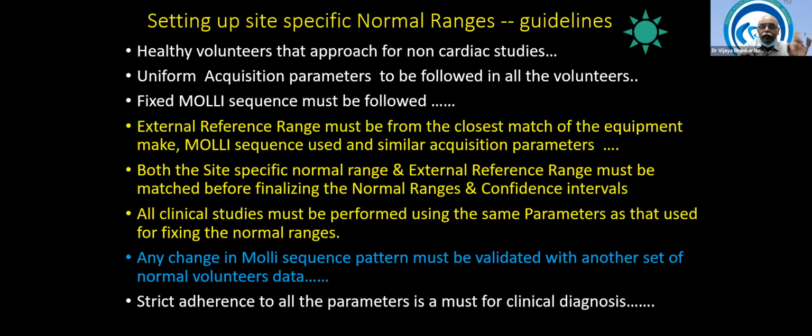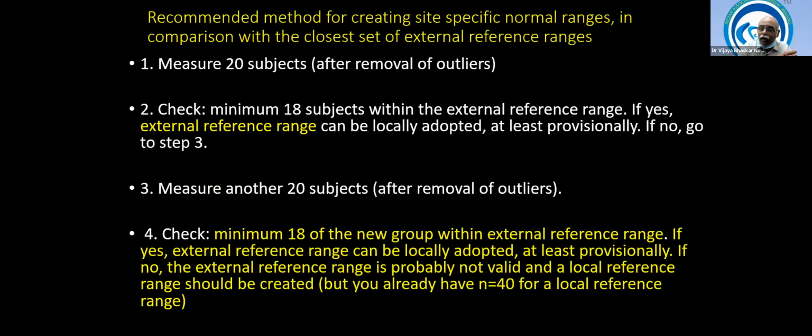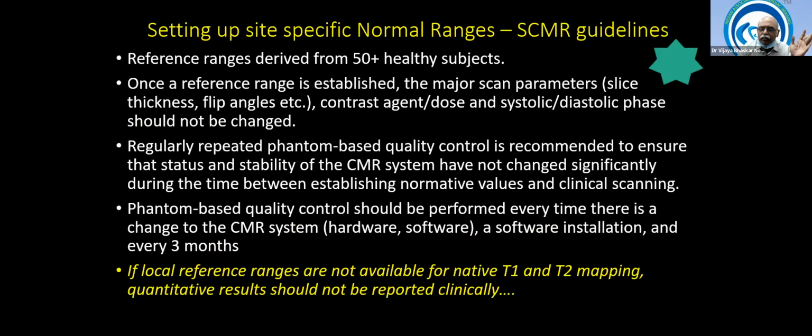I think strict adherence to the conditions and clinical correlation, both are extremely useful here. The slides which I have shown you, think of normal ranges. SCMR says 50 healthy subjects. It's okay, you can try. This is what I thought was quite useful.